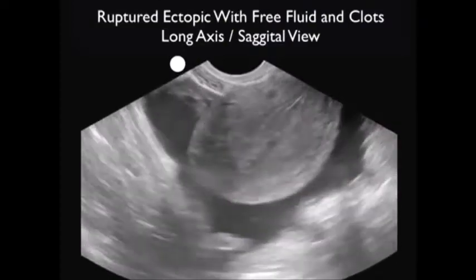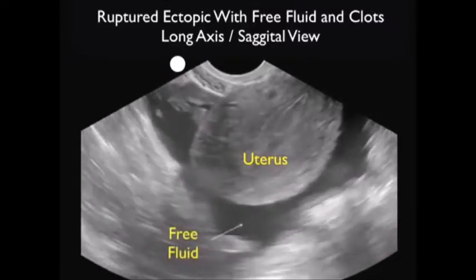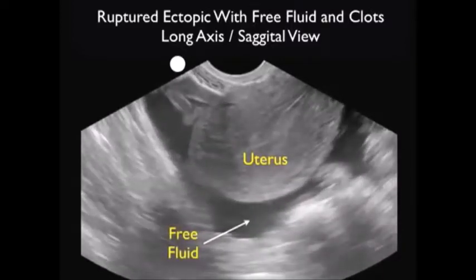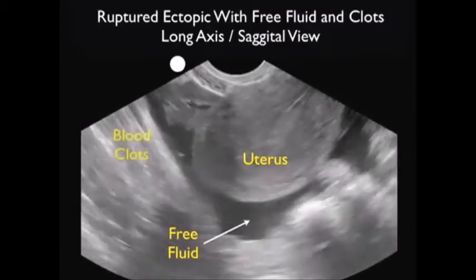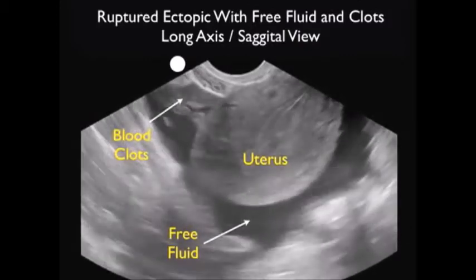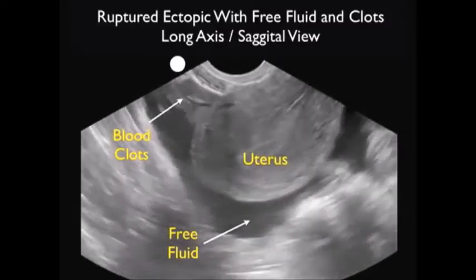Let's begin by looking at some video clips from patients with ectopic pregnancy. Looking at this one, this was a patient who presented with a positive urine pregnancy test, vaginal bleeding, and a large amount of lower abdominal pain. We're looking at a transvaginal long axis view here, and we see the uterus in the middle of the image. We fail to appreciate an intrauterine pregnancy.